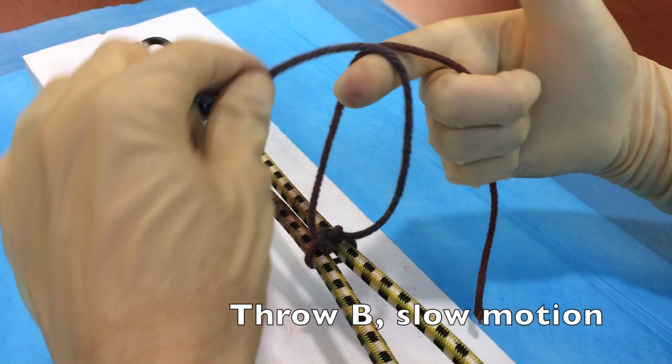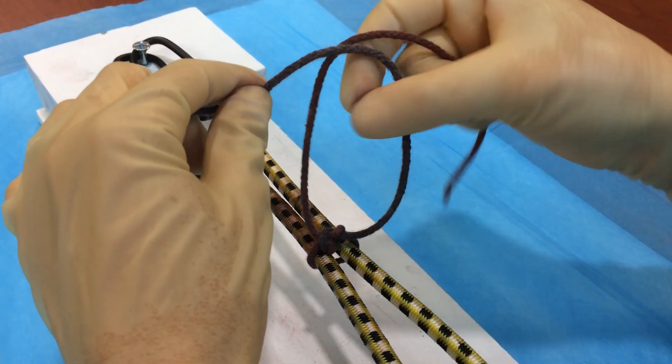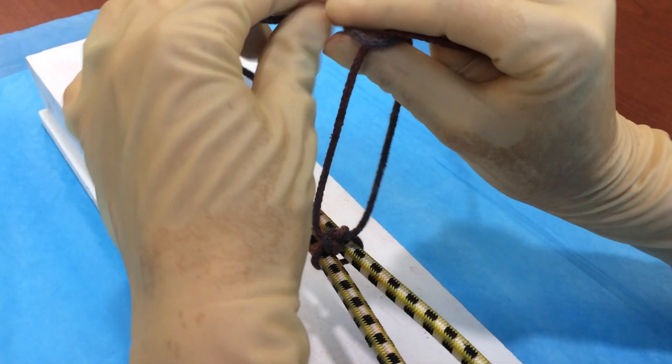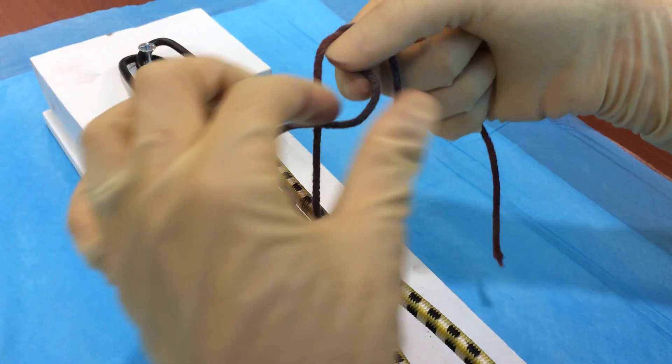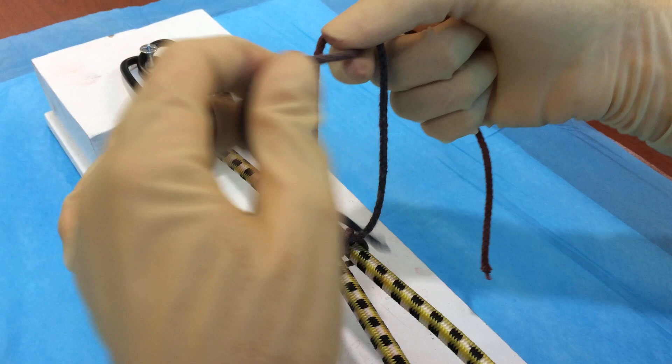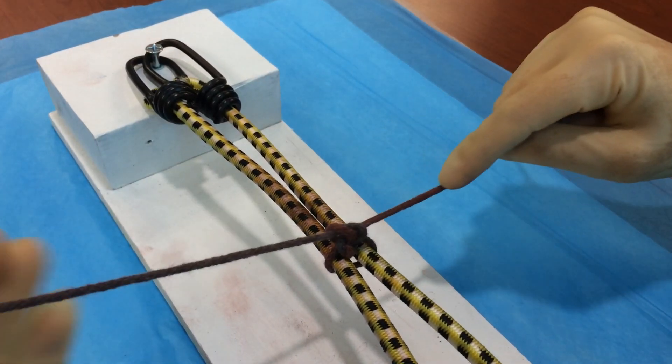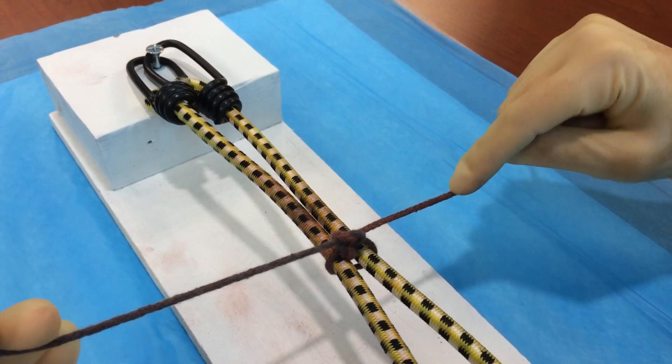Our right hand is in the pistol position. The left-handed strand is then crossed in front of the left side. We're going to create that bird's beak and send it through the loop, grab the suture, and this time we're going to pull it towards us through the center of the loop. Watch as you pull it taut — the knot lies flat and your hands are back in their starting position.